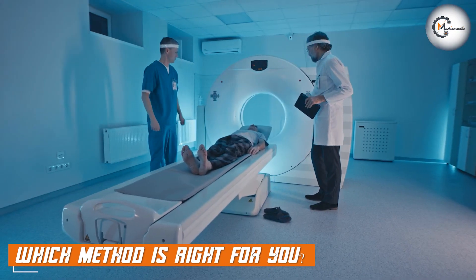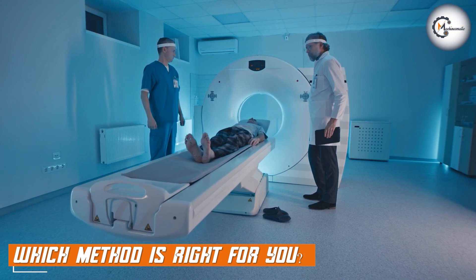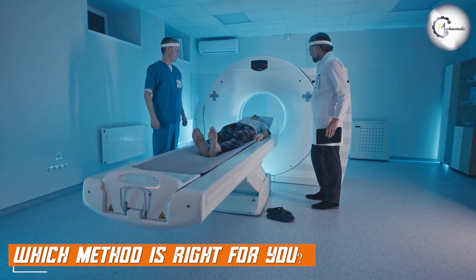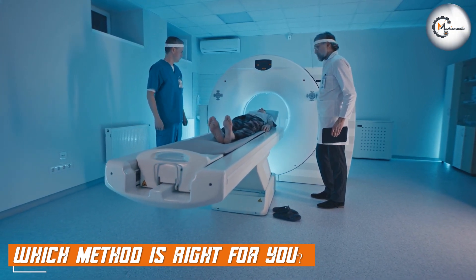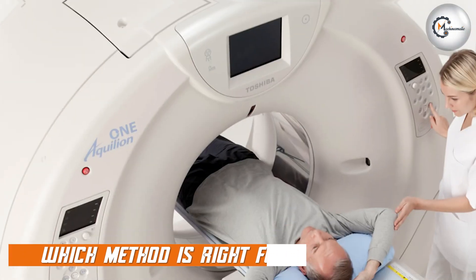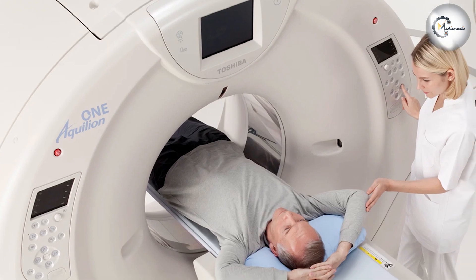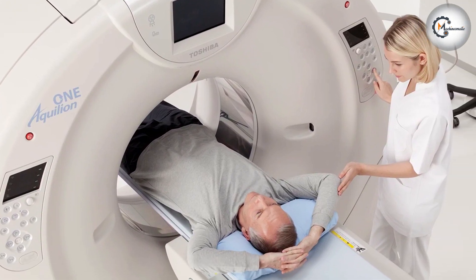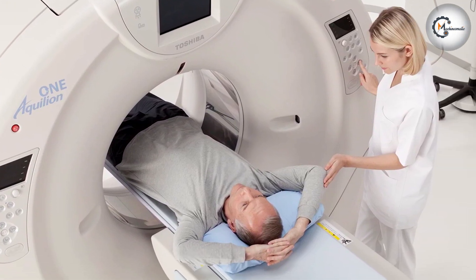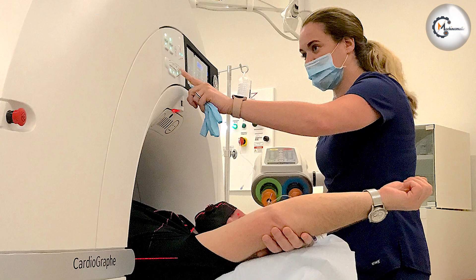So, which diagnostic imaging technique is right for you? That depends on your specific medical condition and your personal preferences. If you are looking for a non-invasive, quick, and relatively low-risk procedure, then a cardiac CT scan may be the best option for you.